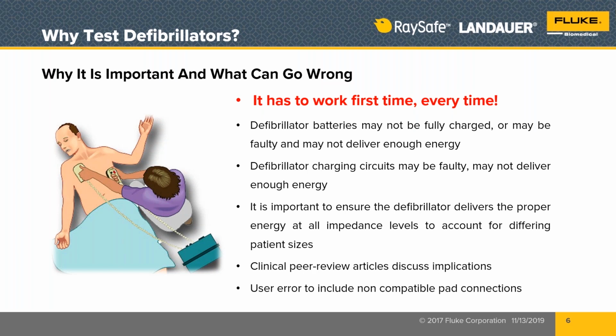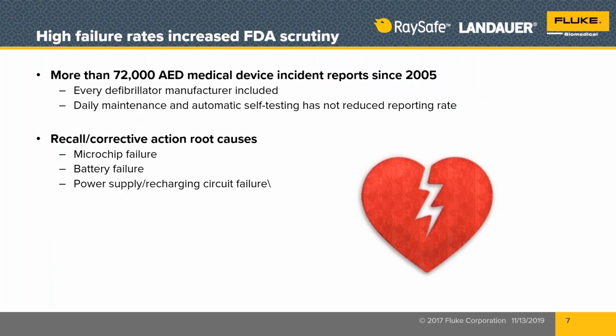So that's the important thing, is the defibrillator just has to work first time and every time when you need to use it. On that, we think about where these are located, and Jerry mentioned earlier some of the locations of AEDs and defibrillators. We also need to talk about the fact that these things are carried around in the back of ambulances, stuck in helicopters, in the back of police cars and fire trucks.